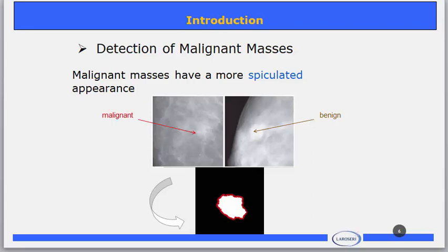The most significant features that indicate whether a mass is benign or malignant are its shape and margins. The shape can be round, oval, lobular, or irregular. Circumscribed, oval, and round masses are usually benign. An irregular shape suggests a greater likelihood of malignancy. Here, we need to segment and extract the boundaries of the tumor for making better decisions.